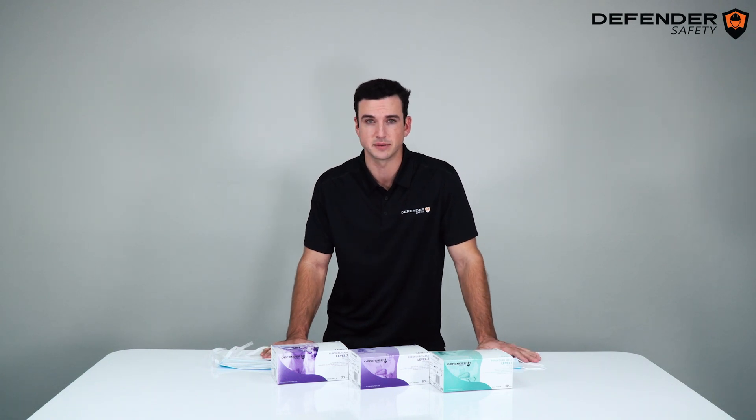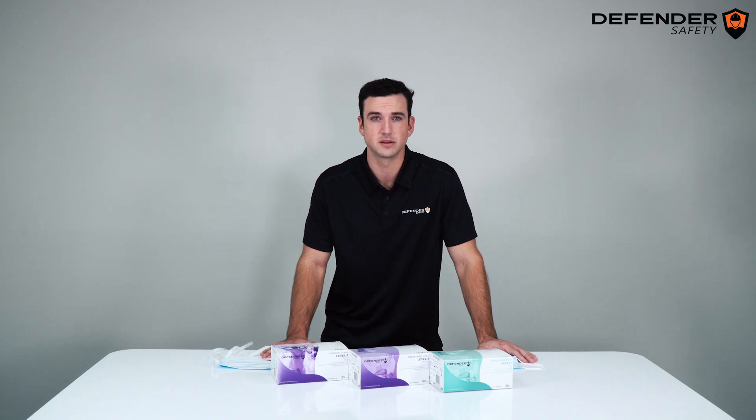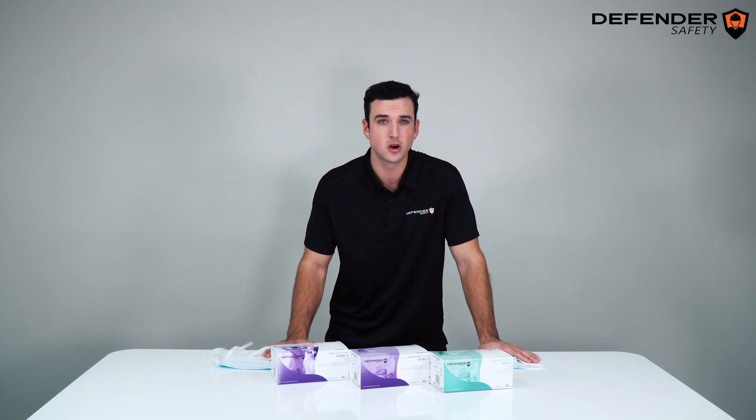We saw ear loops snapping, inconsistent materials, rashes forming, foreign language on packaging, unknown performance levels, and testing that was inadequate.